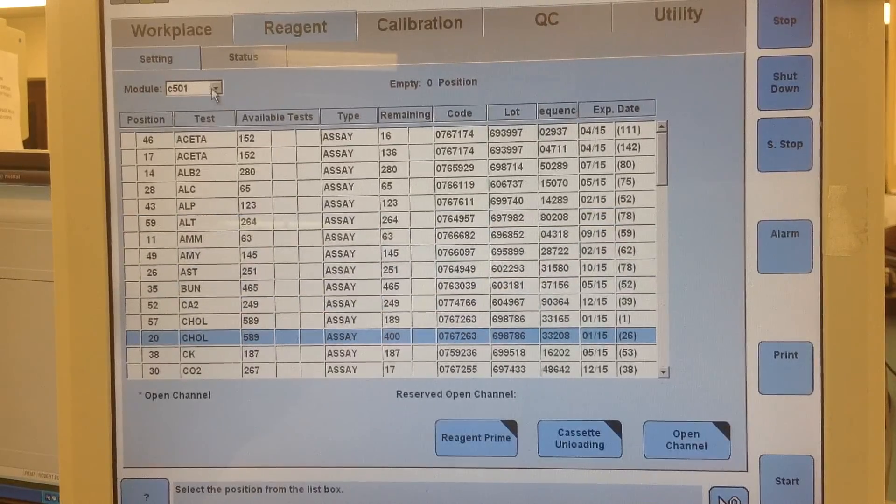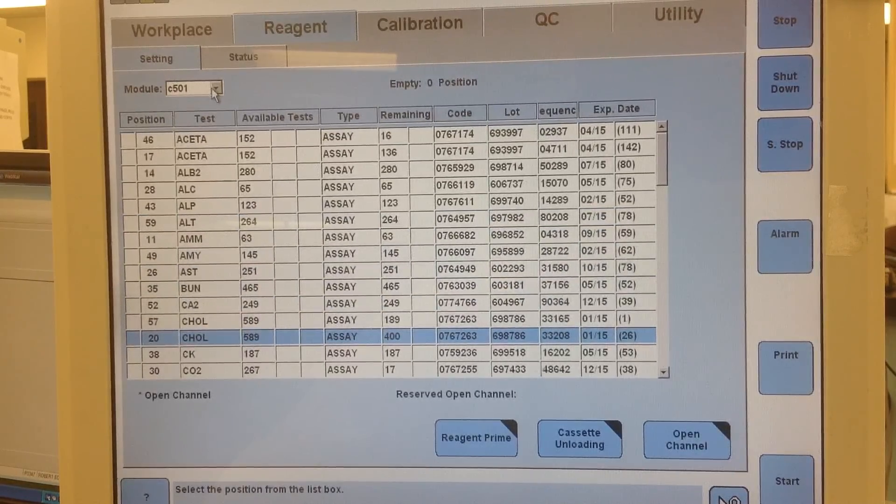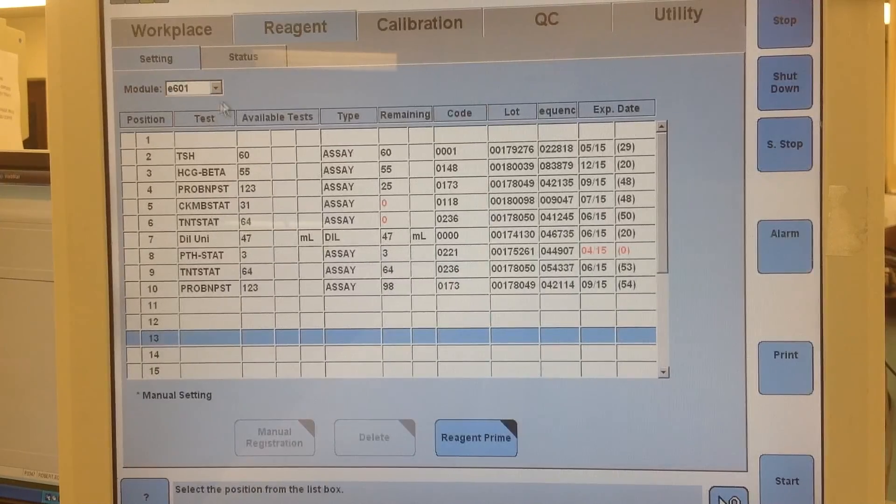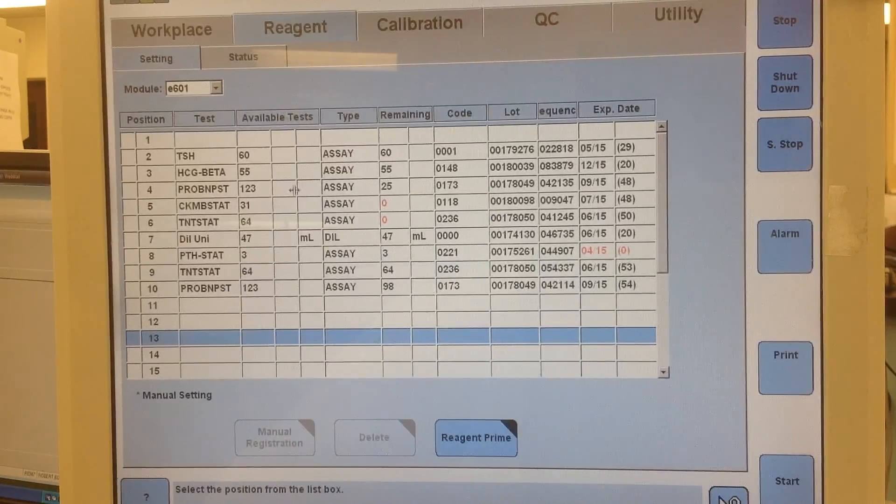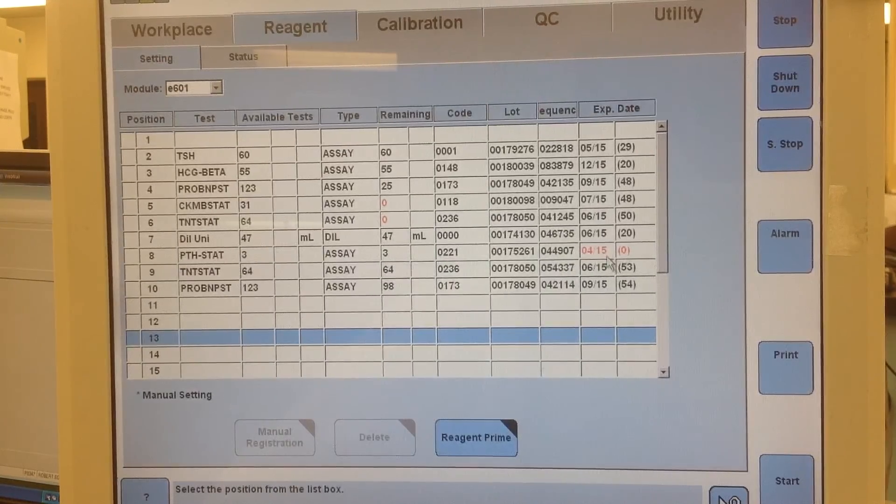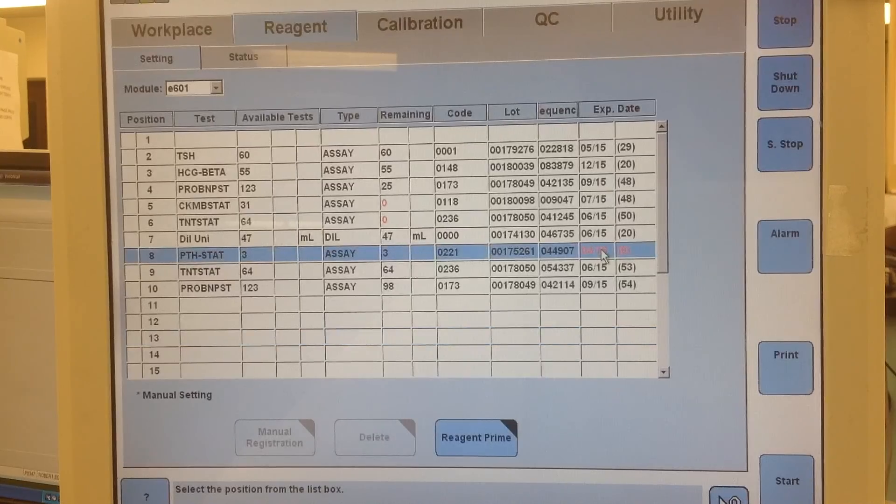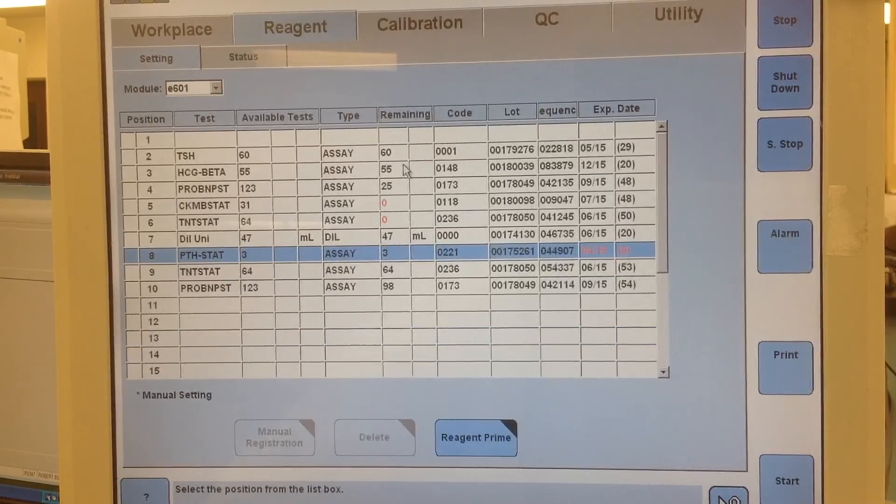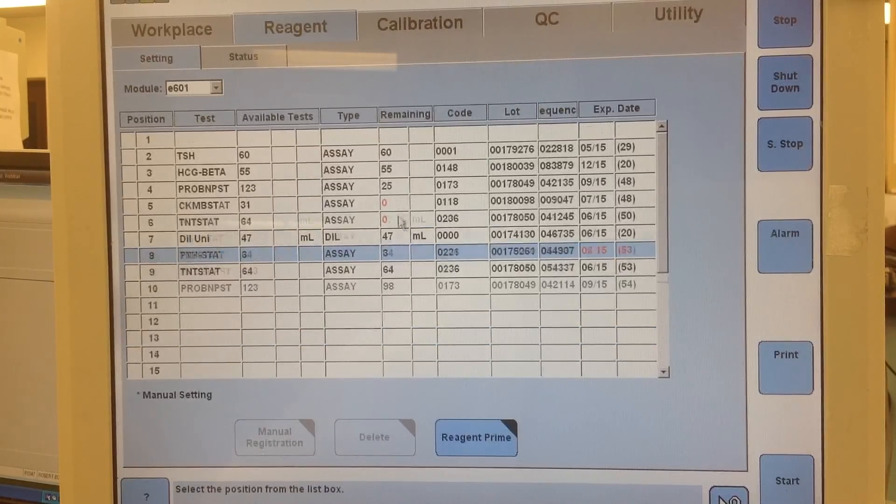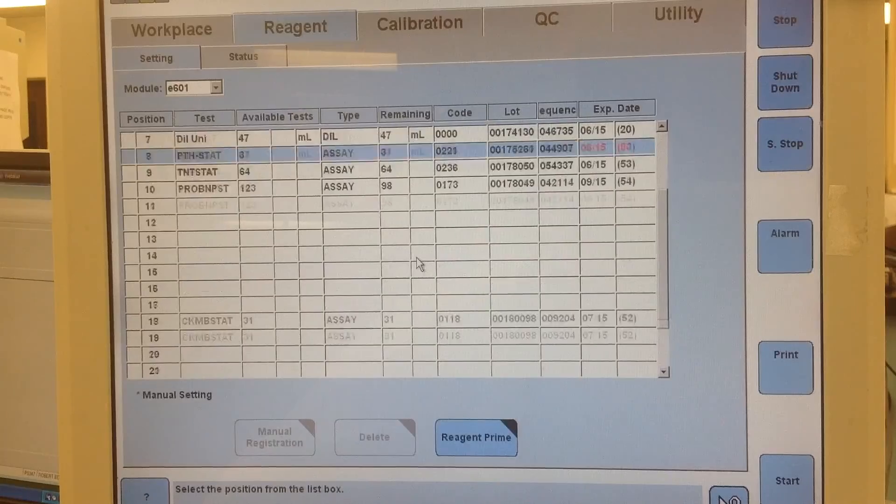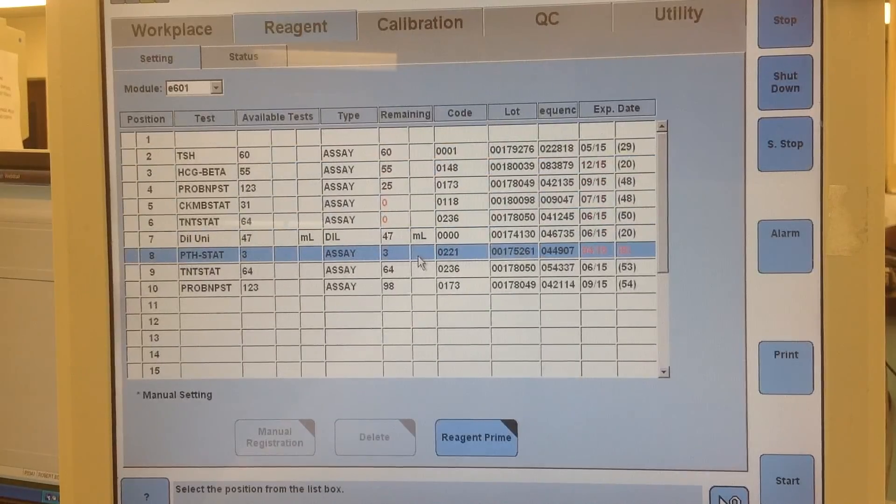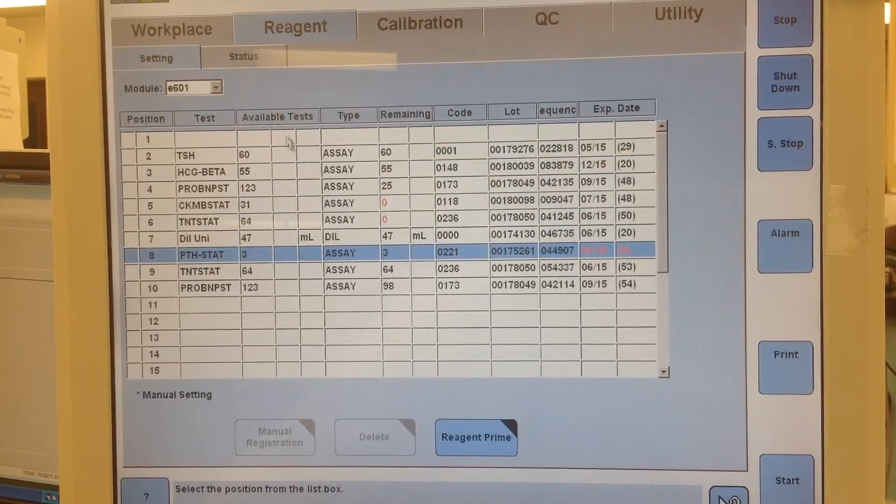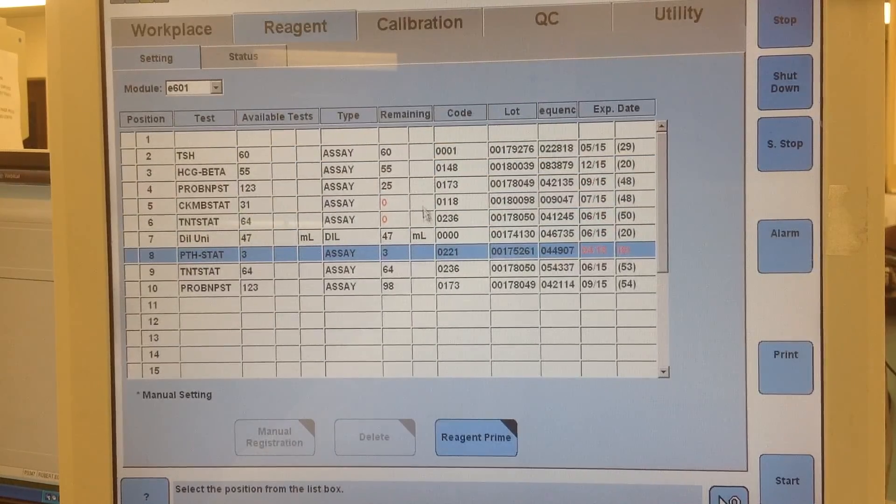And then you can switch to the 601 side and this basically just shows you, see here PTH has expired. You can see the same thing, how many remaining tests there are on each one.